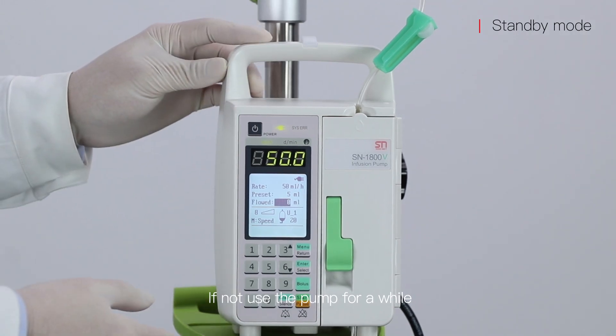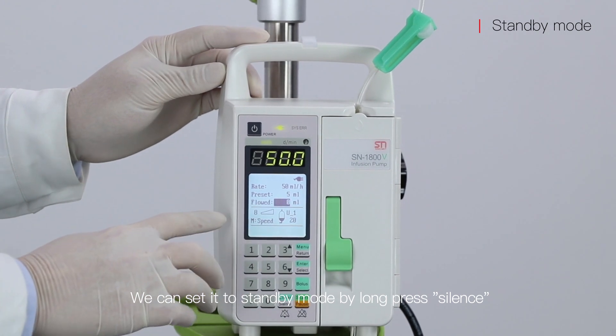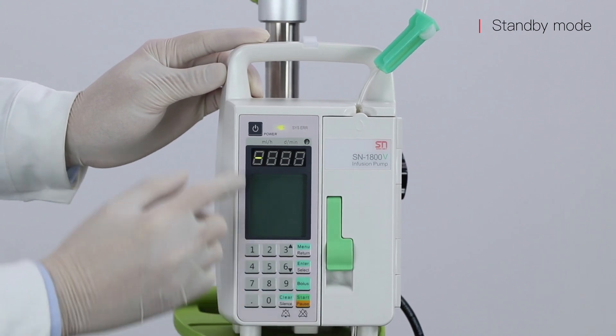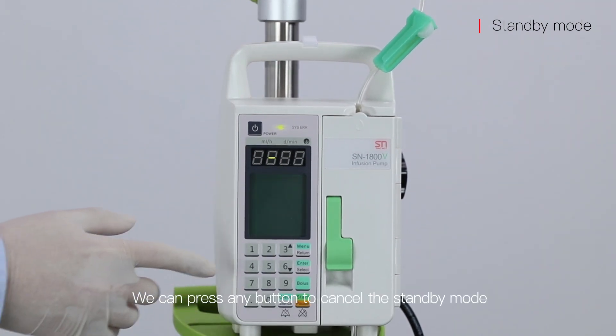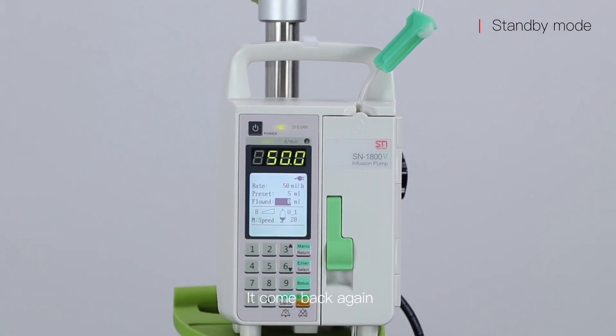If not using the pump for a while, we can set it to standby mode by pressing and holding the silence button. It is now in standby mode. We can press any button to cancel standby mode and it will come back again.